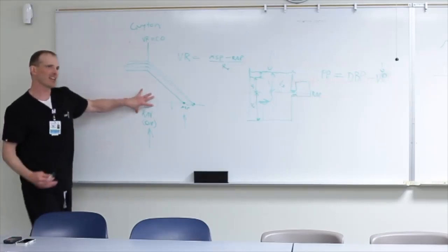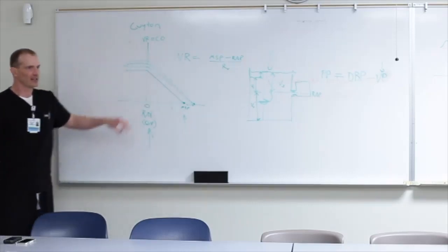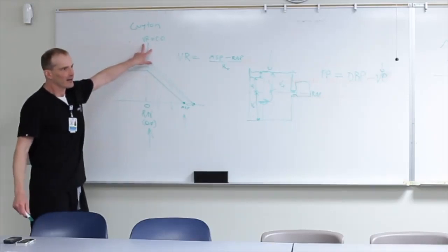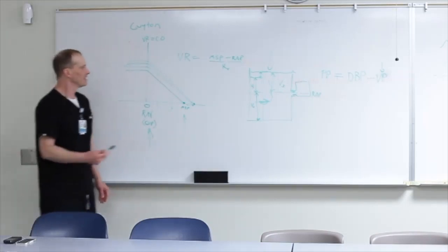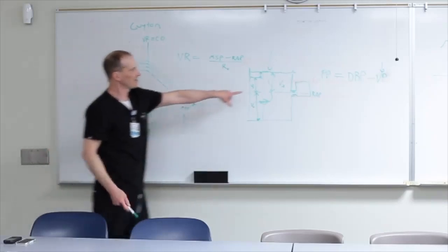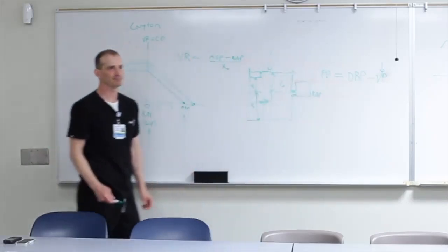In other words, can we give some more fluid and get away with it, hoping that it causes an increase in venous return and cardiac output, okay? Or is the IVC telling me, hey, back off, okay? Because ultimately it's going to decrease the venous return, and it's also going to ding the perfusion of our organs, okay?